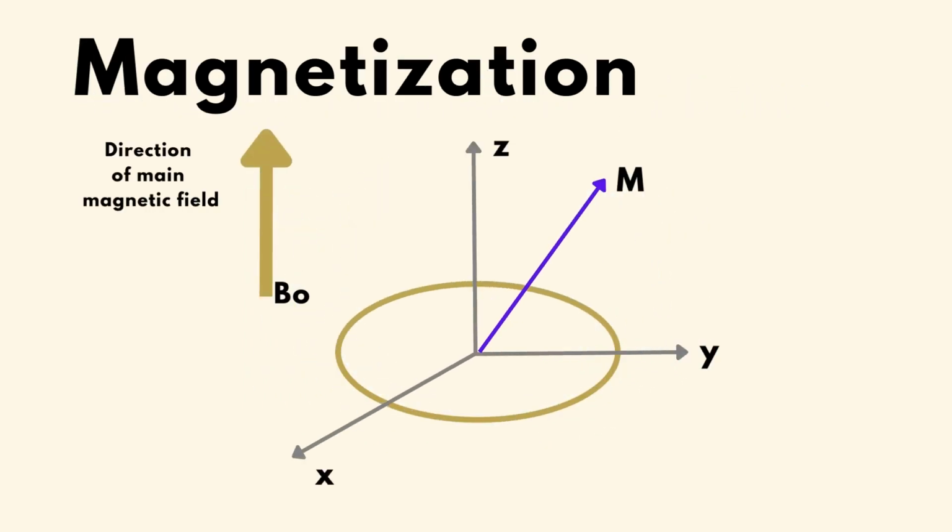Since the number of protons with an axis rotating in the same direction as the external magnetic field is always larger than the number of protons rotating in the opposite direction, the combined effect of the nuclei aligning with the external magnetic field produces magnetization along the external field. This is the net magnetization. The net magnetization increases as the external magnetic field strength B0 increases, or in other words, the net magnetization is proportional to the external magnetic field strength B0.